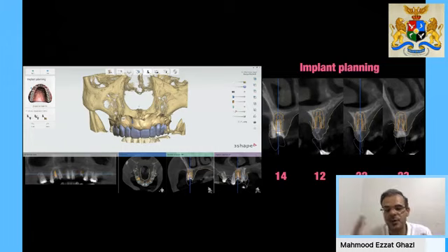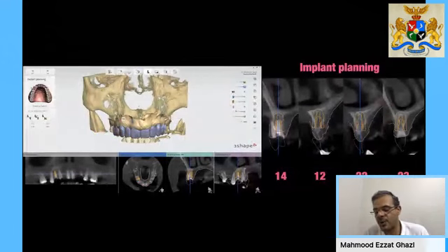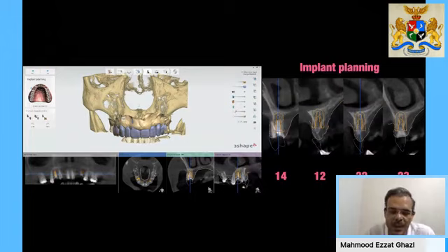So this is where you start to really improvise and adjust according to each case and give the most benefit for each patient, of course. So here we started to plan for teeth 1-4, 1-2, 2-2, and 2-3, the exact positions of the implants. And from there, this is when we finished our total plan for the case. We have the aesthetic proposal, the biological principles in mind, function and occlusion in mind, also how this is going to look on our patient at the end.